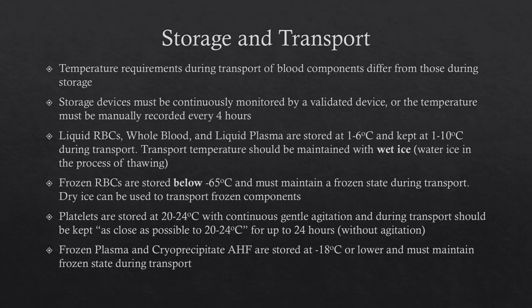All of our blood storage devices must be continuously monitored, and if you don't have the ability to continuously monitor the temperature on a device, then you have to manually record the temperature every 4 hours.